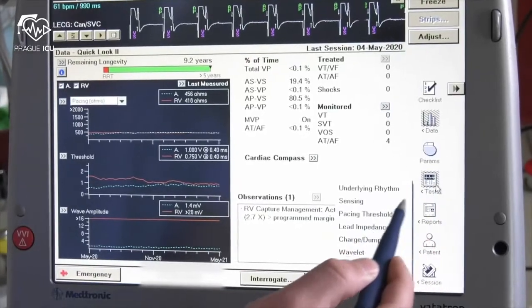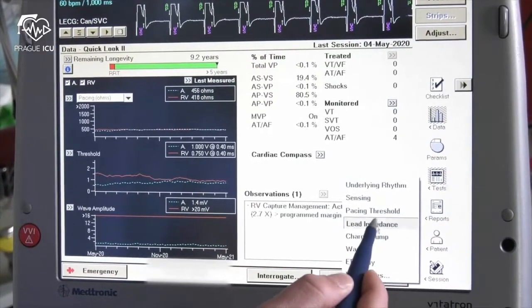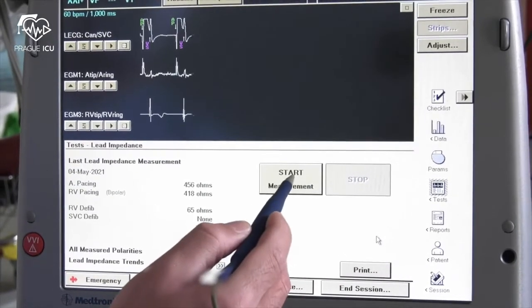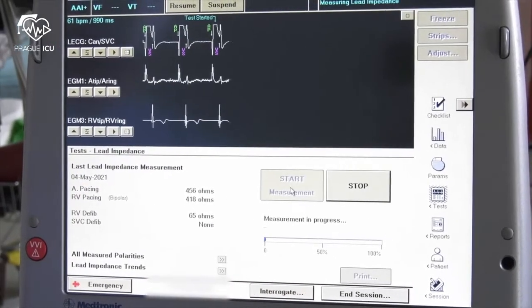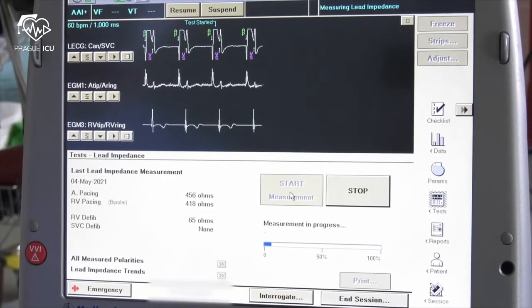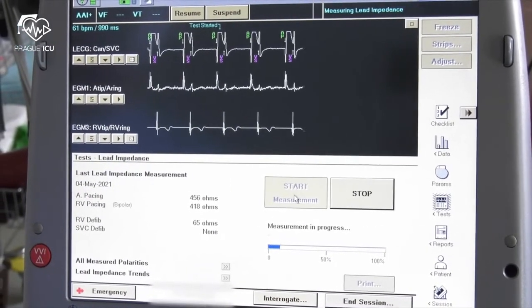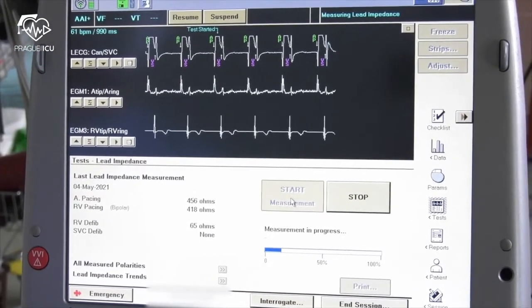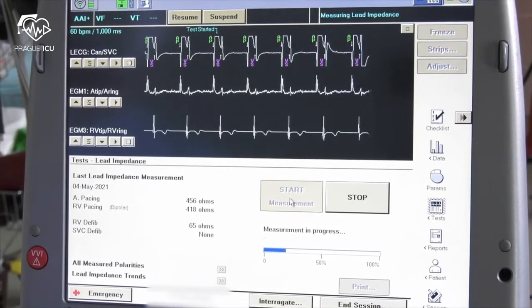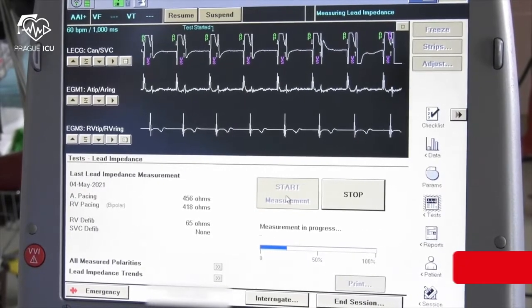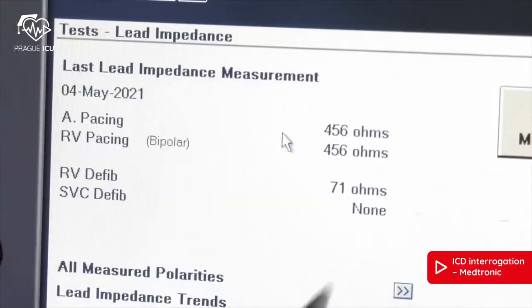For lead measurements go to the test button and choose the type of measurements. Start with lead impedance. In the lead impedance window click on start measurements and wait for the measured values.